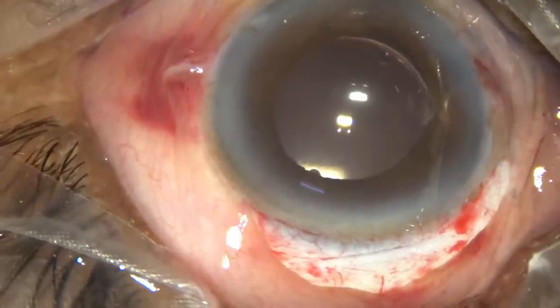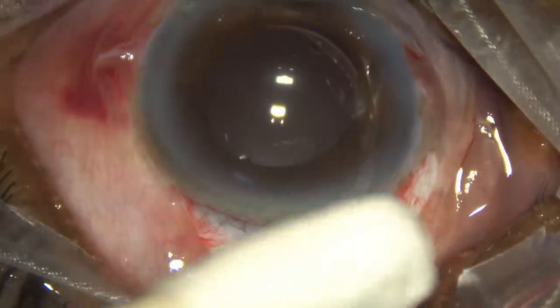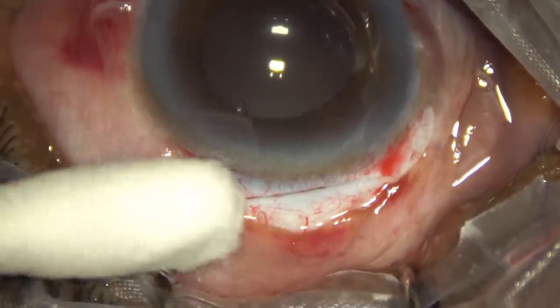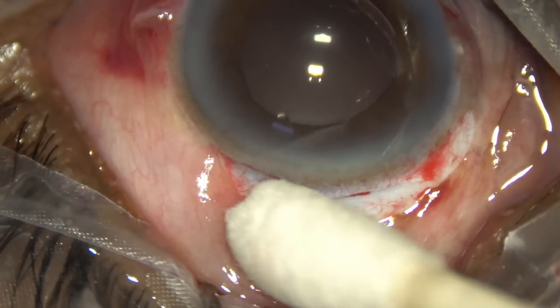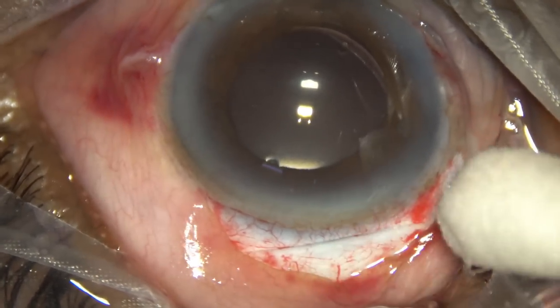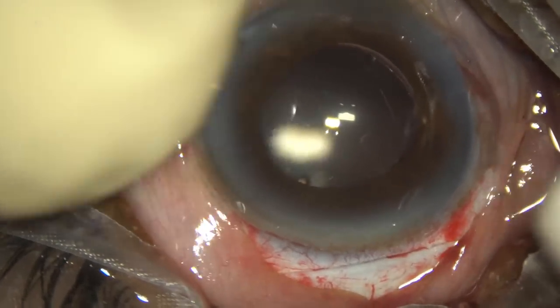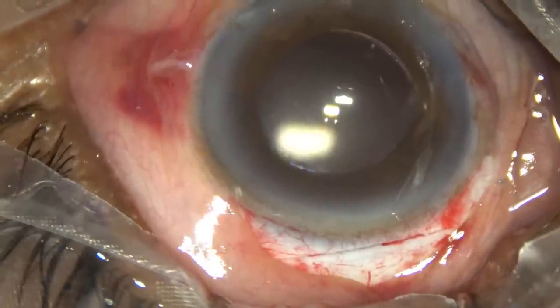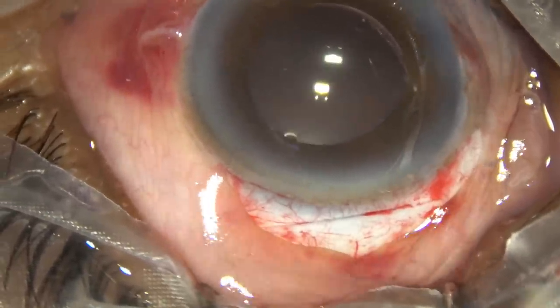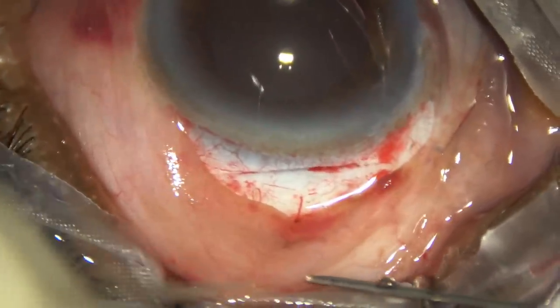Now check if there is any leakage of fluid from the wound. There's no leakage. The wound margins are nicely opposed. Intraocular pressure is fine. And now we're going to inject subconjunctival dexamethasone and gentamicin. And this conjunctiva will go forward and it will get attached to the limbus.